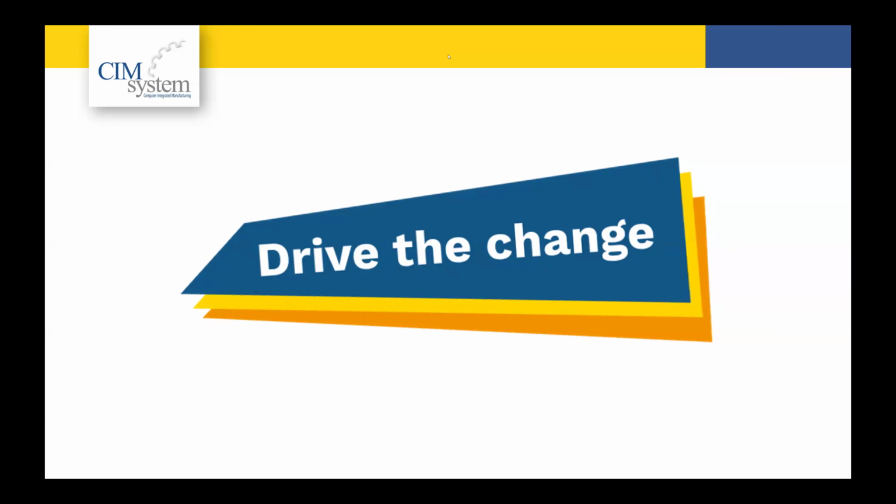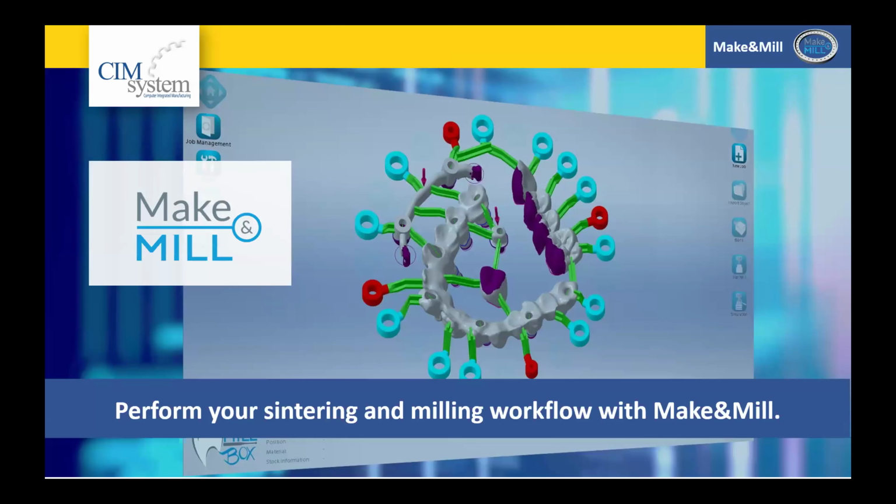I try, and I hope I do, to help customers solve practical problems and improve their daily workflow with our software tools. So today, the main goal of this webinar is to help you understand how to get the most out of Make&Mill, from importing STL files to generating toolpaths, especially focusing on how this system helps dental labs prepare models for milling quickly and correctly.